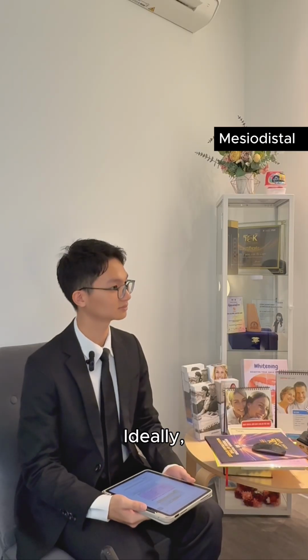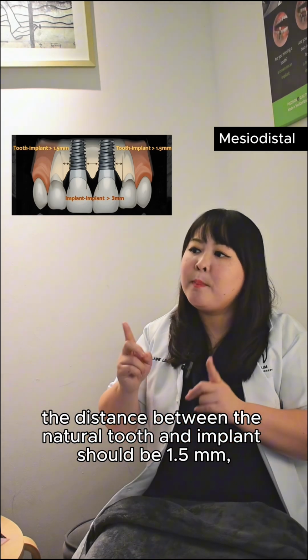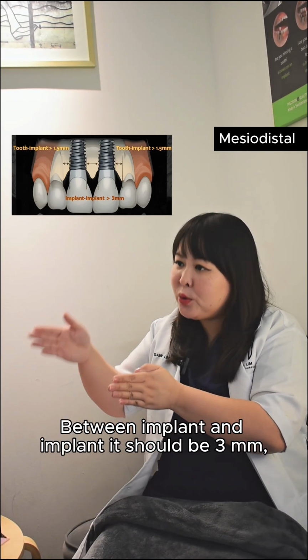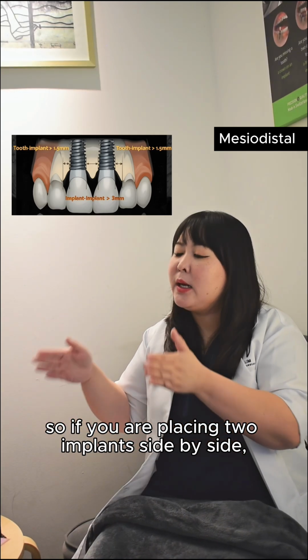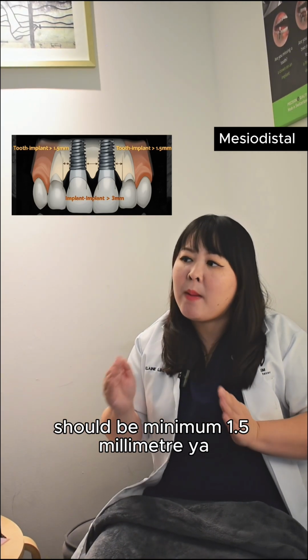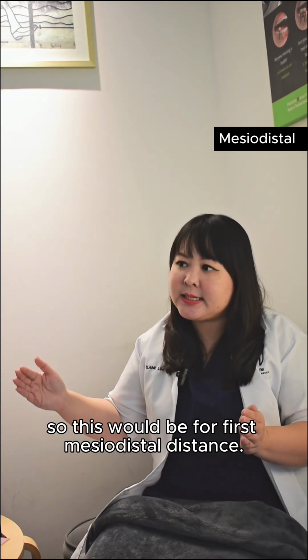Ideally, the distance between the natural tooth and implant should be 1.5 mm. Between implant and implant, it should be 3 mm. So if you are placing two implants side by side, it should be 3 mm. Between implant and the tooth should be a minimum of 1.5 mm. So this would be the first, the mesial-distal distance.